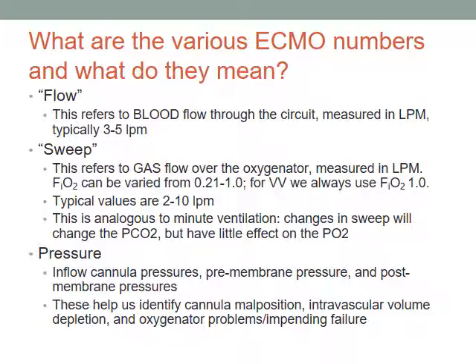Pressure changes help us identify cannula malpositions, intravascular volume depletions, and oxygenator problems, as well as impending failure of the oxygenator. Okay. And one of the problems of putting together one of these talks is there's a lot of basics that right now are gonna make no sense. So if you don't even know what the circuit looks like, this is all gobbledygook.